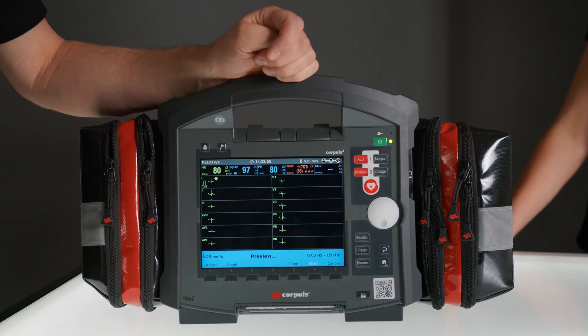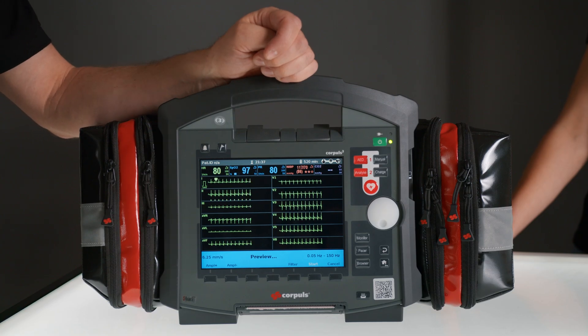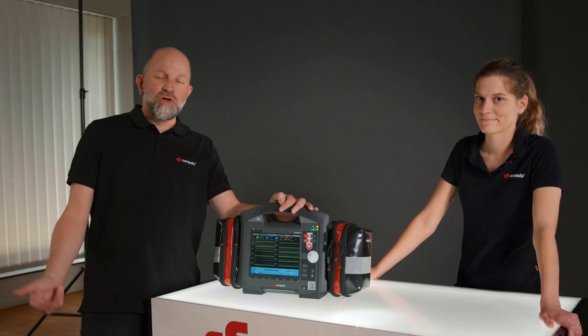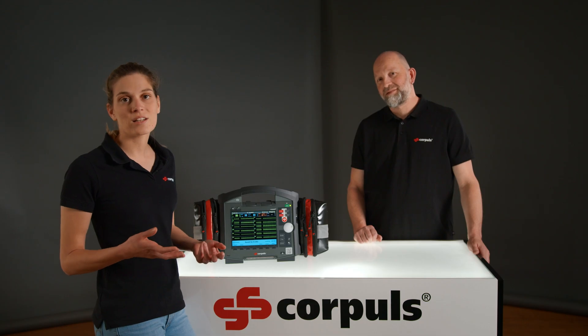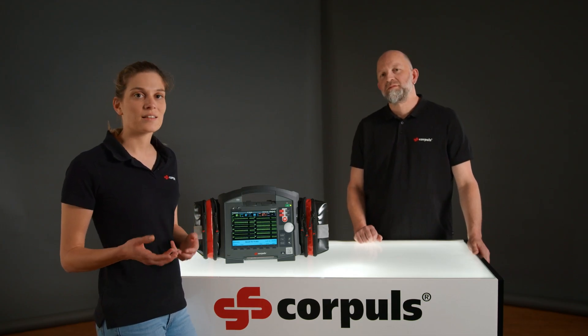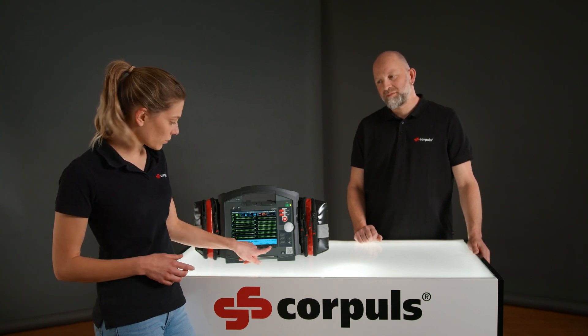The device will create a preview of the last 10 seconds at a sweep speed of 6.25 millimeters per second. All leads are shown here and we can check again for possible artifacts or loose ECG electrodes. If you still see a wandering baseline, we recommend that you wait a moment until the conductivity of the ECG electrodes on the skin has improved. Otherwise, you can now press start.